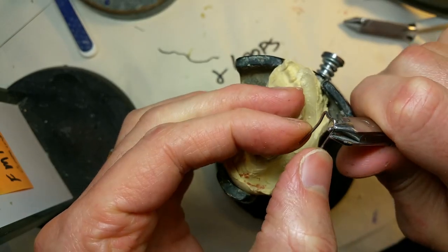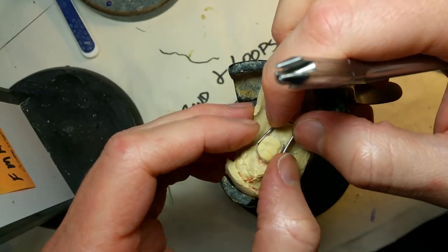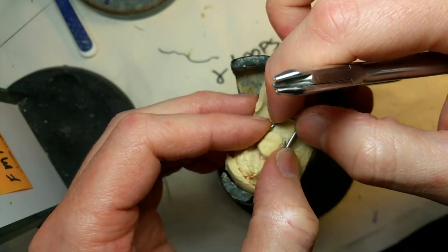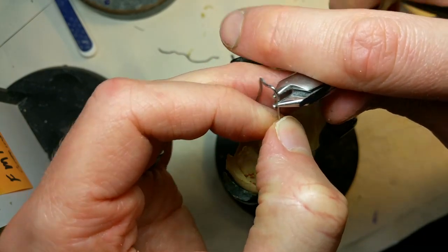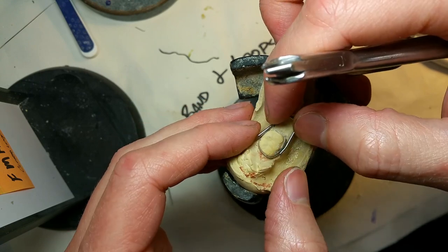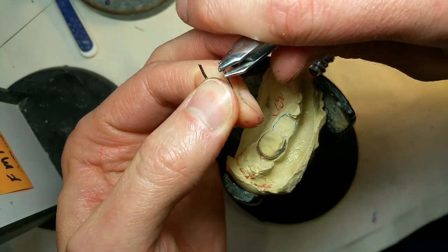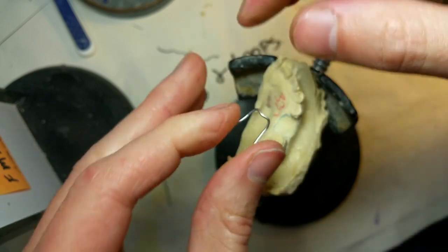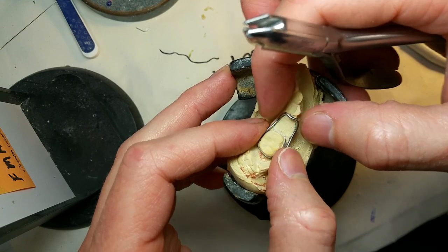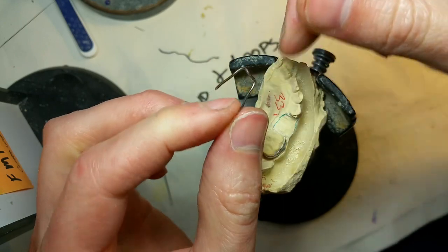So this is kind of a preventative measure. It's designed to stay in there a while, so I'm contouring it to make it as comfortable as possible for the patient. I'm using my three-prong pliers, just doing some light contouring — I like a little bit of an hourglass shape. I'm checking it, making sure it hugs tightly against the band, but not so tight that it springs up, so I won't need a huge solder joint to grind down later.